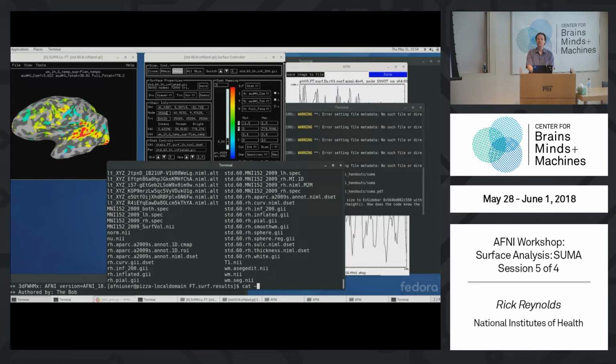The macaque has also something similar, the macaque atlas? Does it have something similar? Well, you'd have to rely on having that spherical registration step done. So if you gave FreeSurfer macaques and the macaque cortical patterns matched the human patterns well enough, subject to that, you'll get it. But at least I remember that the F99 had a spherical map also.